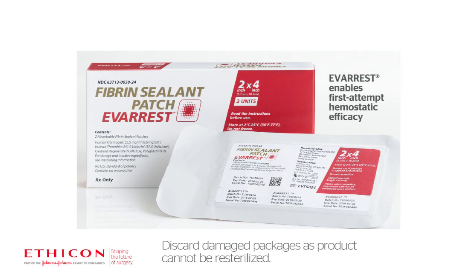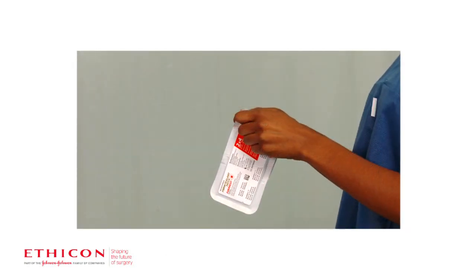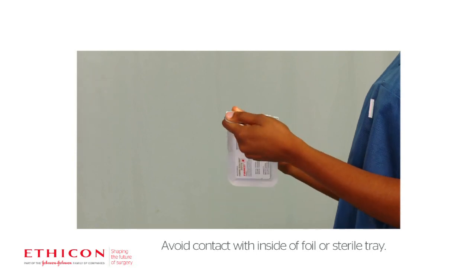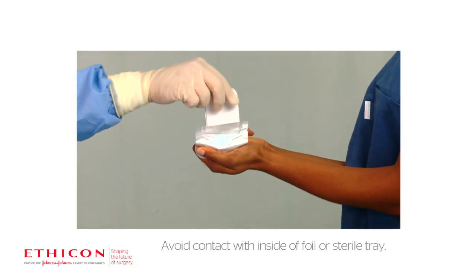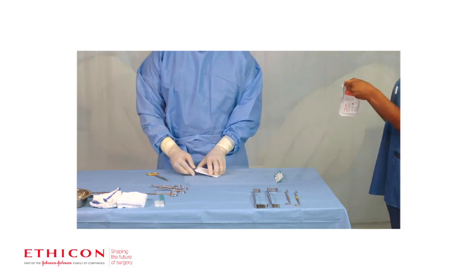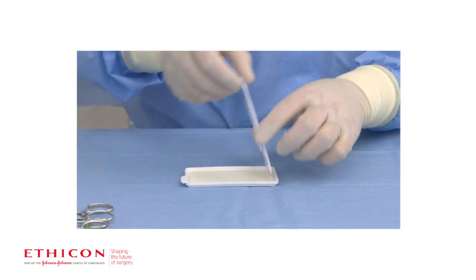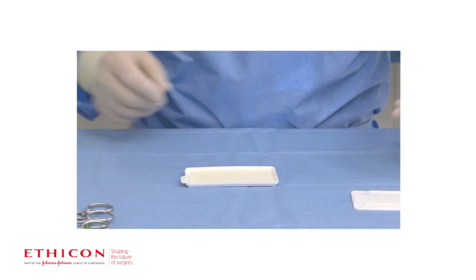To open the product, after removing the foil pouch from the carton, carefully peel open the foil pouch. Remove the tray and place onto the sterile field. Hold the tray securely, ensuring that the side with the holes is facing upwards. Use the tabs on the side of the tray to remove the top with the other hand.